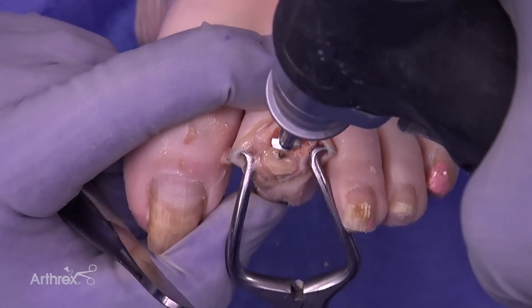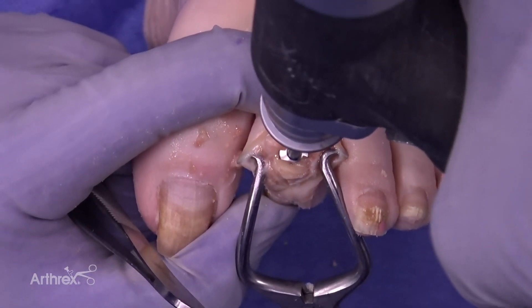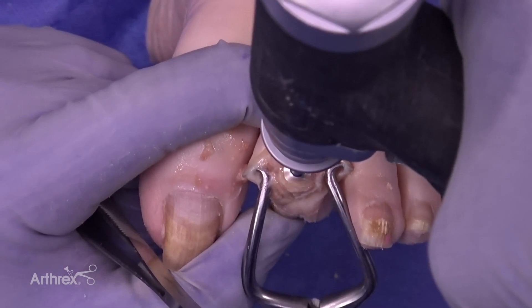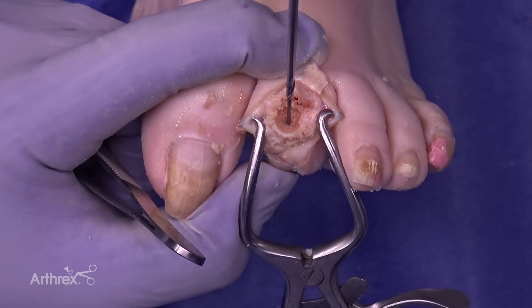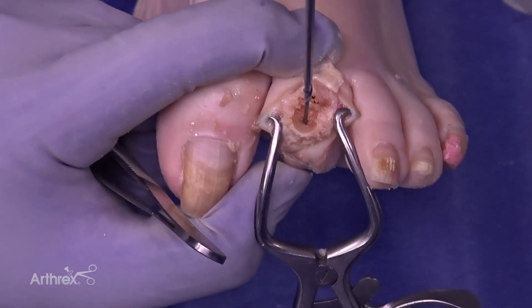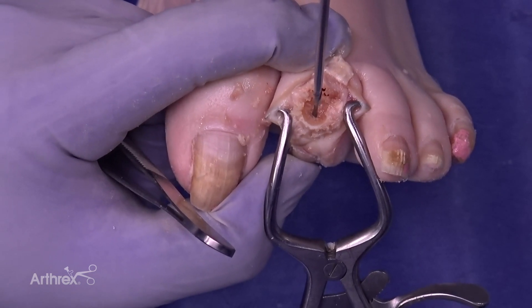Now we're going to use the convex end of the corresponding reamer to prep the base of the middle phalanx. Then we'll utilize the 2.5 millimeter drill to prepare the base of the middle phalanx, drilling down to the laser line on the drill.